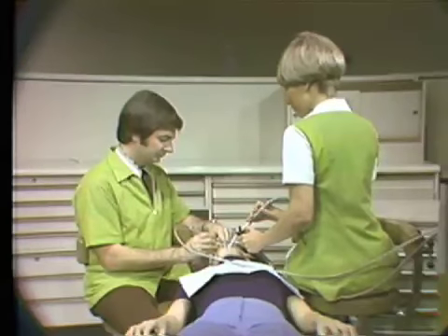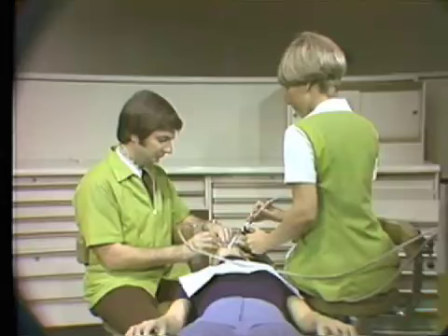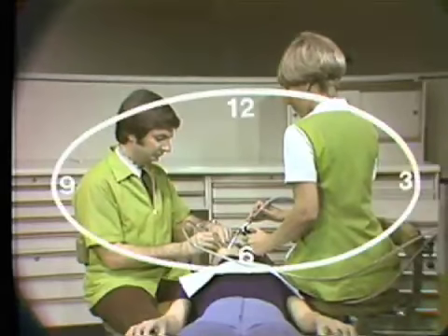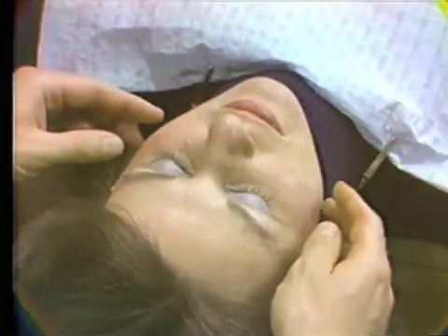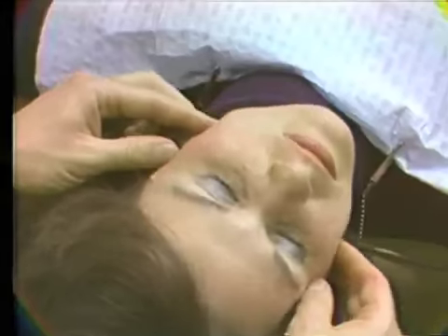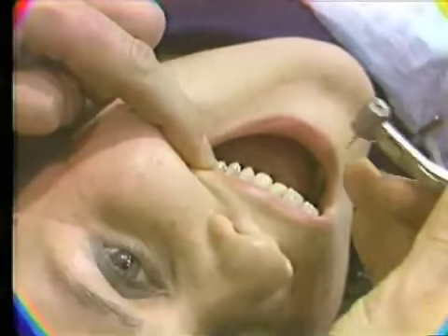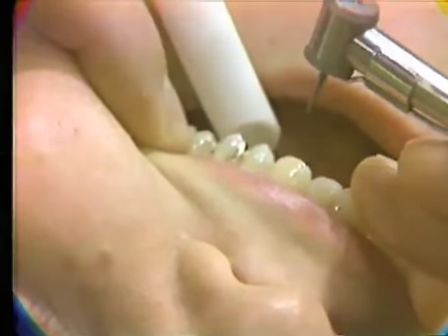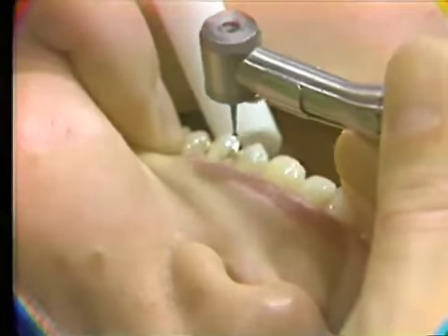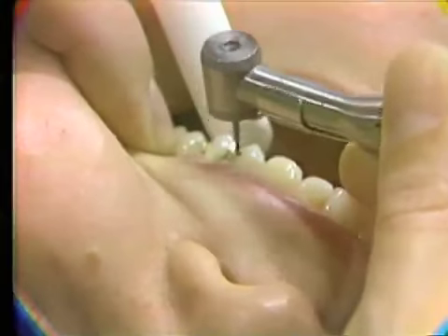Access and comfort for the operator is enhanced by placing the patient in supine position. The operator can then work from the 10 o'clock position. Final adjustment to improve access is accomplished by turning the patient's head considerably toward the operator and slightly elevating the chin. Once the operator and the patient are in position, retraction is accomplished with the operator's left index finger. Finger rests are established on the incisal edges of the anterior teeth, and the evacuator tip is placed along the occlusal surfaces near the tooth being treated, with the opening directed toward the handpiece.